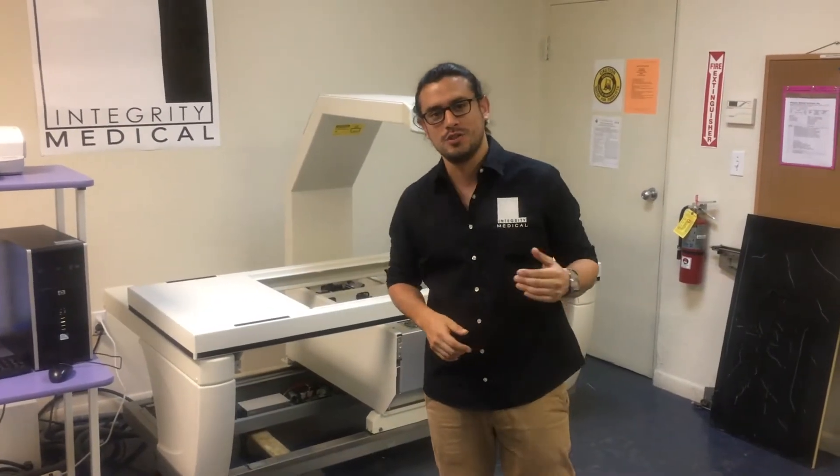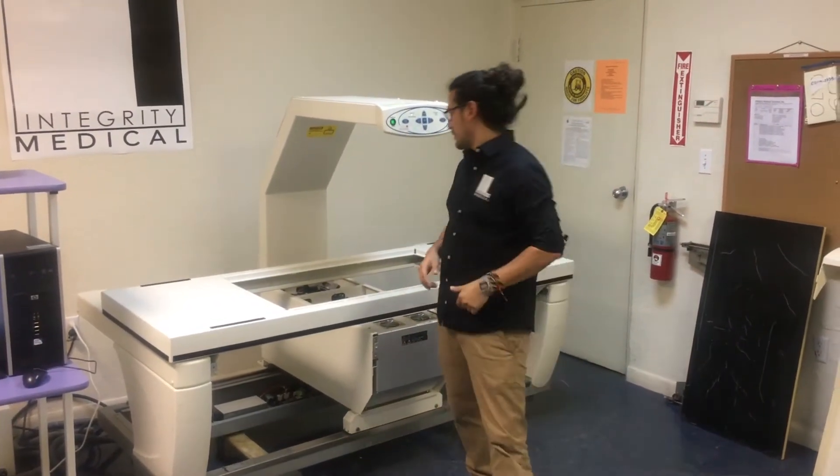Hi, my name is Willy. Today at Integrity Medical, we're going to take a look at this DEXA machine.